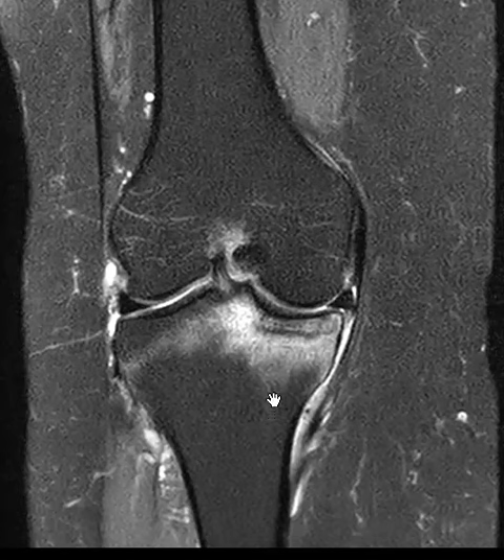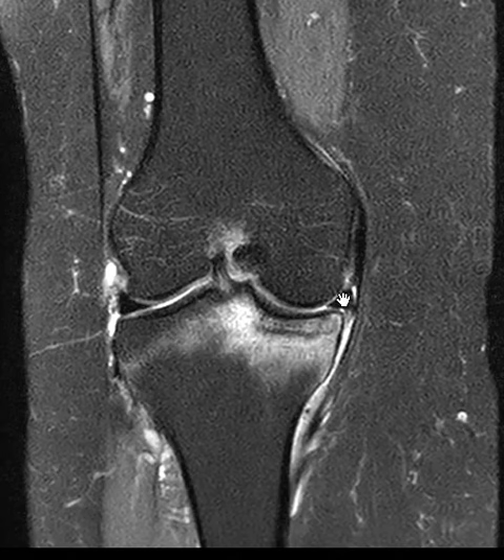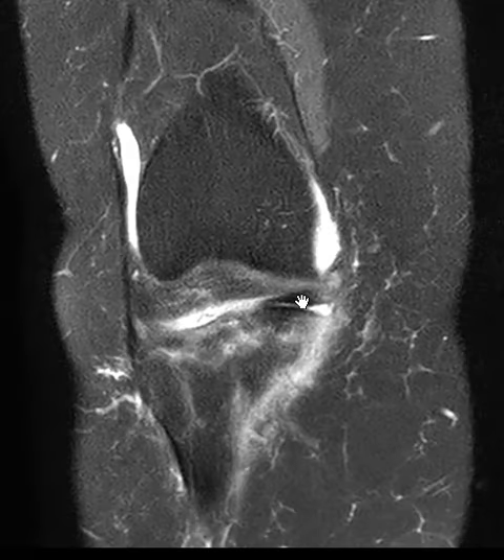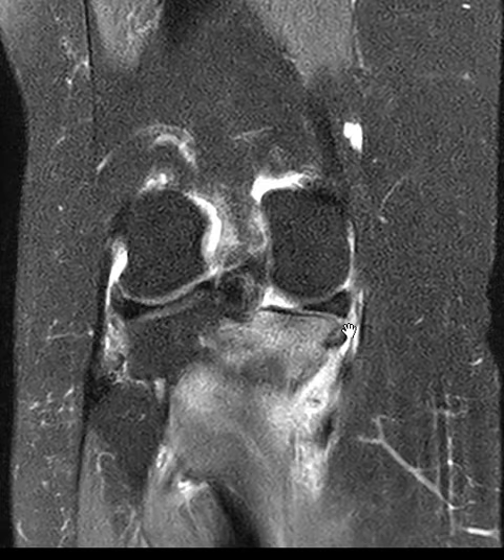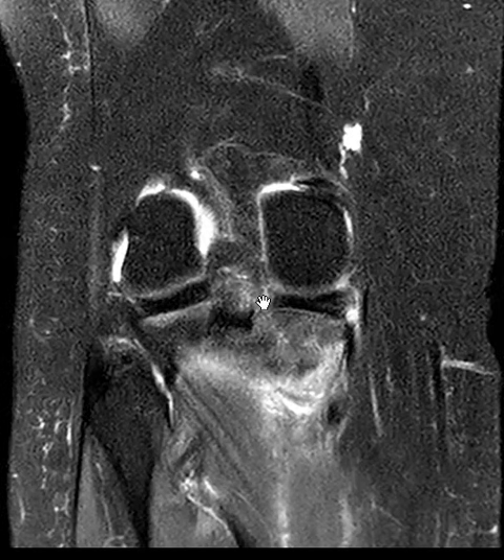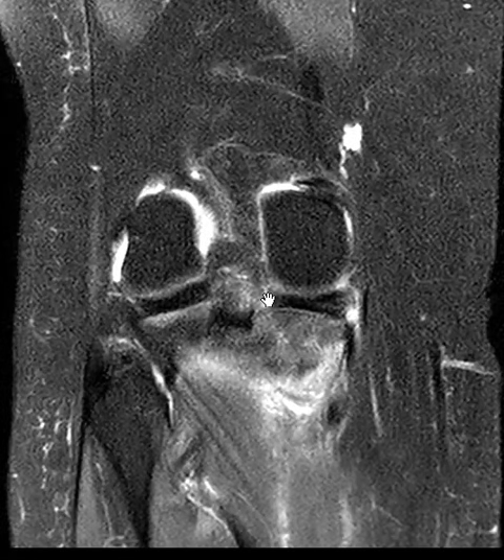Other times patients can do too much exercise or overuse, or they'll have a meniscus tear where the meniscus is not working as a shock absorber, and that can lead to a stress fracture. So we're going to look at this meniscus — it looks good here as we go around the front. Meniscus looks great in the front, and as we go around to the back, this is the posterior horn, and there's a little vertical band here. There's a little bright spot here that should not be present.